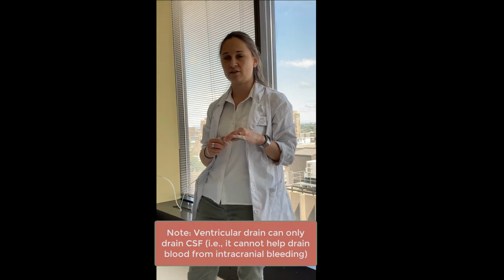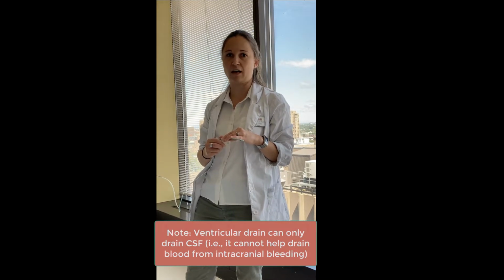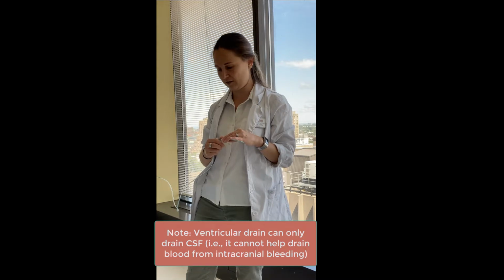The reason for inserting an external ventricular drain is usually to either monitor intracranial pressure, or ICP, or to drain CSF. The reasons why we might want to do that is usually in cases where a patient has a severe intracranial bleed, where the intracranial pressure rises and we need to relieve some of that pressure by draining the CSF, or in cases of severe hydrocephalus where again the ICP is increased.